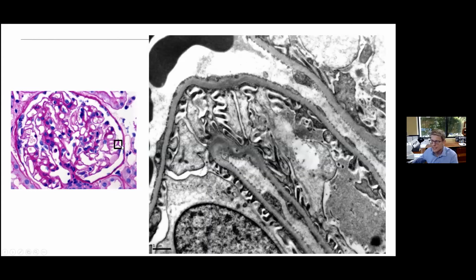We can go even higher if we want to blow this up a little more. We really want to see that glomerular basement membrane. We want to see it at a power of maybe 15,000 times. That's what I'm showing here. So here you can see the glomerular basement membrane. You can make out the inside. So here's a red blood cell. We're in the blood, the capillary space where the blood flows.